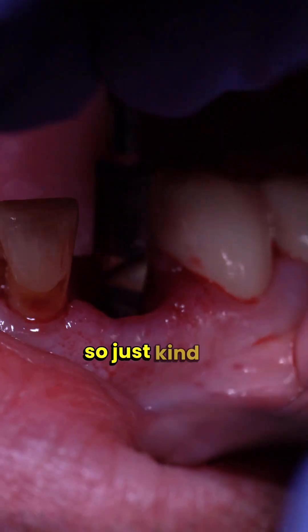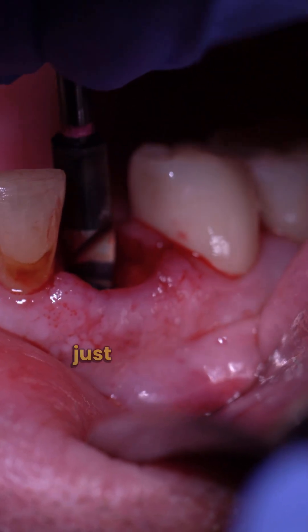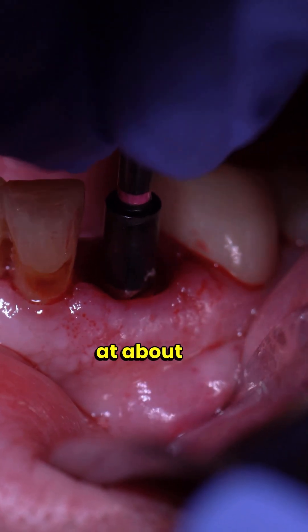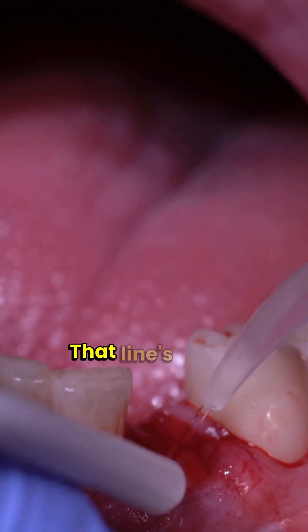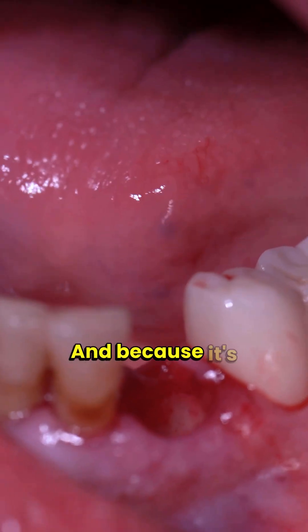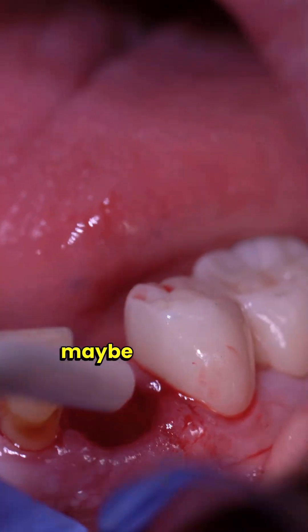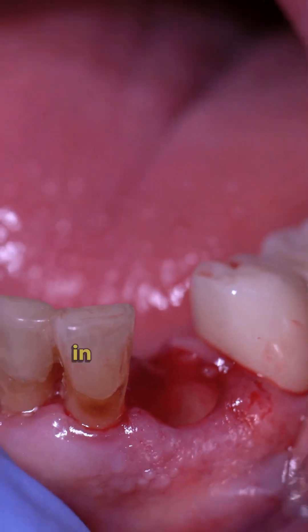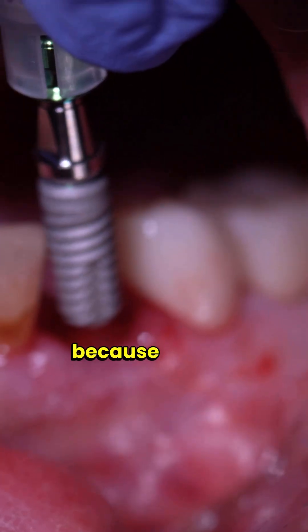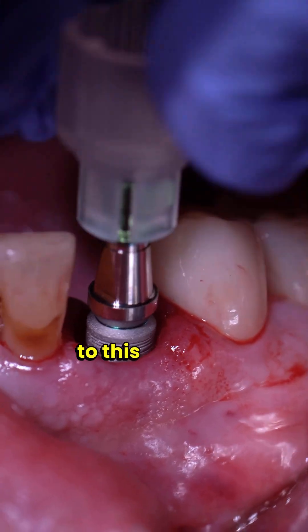There wasn't much material to remove in this one. Now I'm getting my first drill and placing it in the socket just to approximate how deep the socket is — it's about 13 millimeters right at that line. I'm going to irrigate and clean that out. Because it's approximately 13 millimeters, I'm thinking I could just place the implant in and see if it engages, because the socket is really similarly sized to this implant.